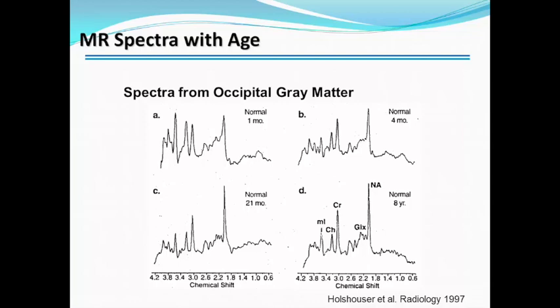Yeah, there are tons of analysis programs, including LCModel, jMRUI, Tarquin. There are tons of analysis programs to do this. And LCModel is only $15,000.